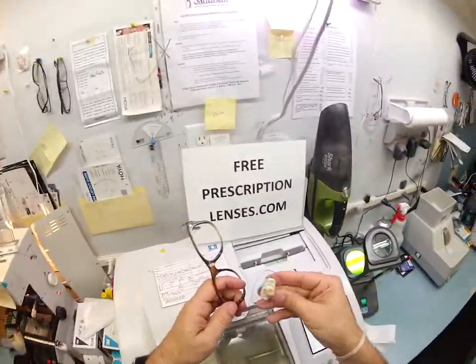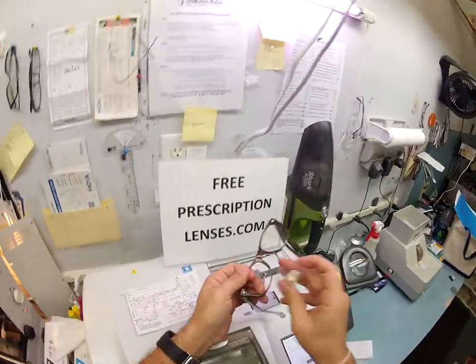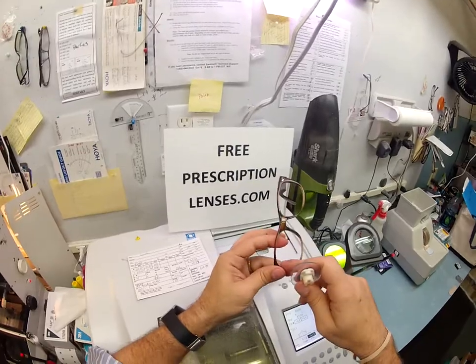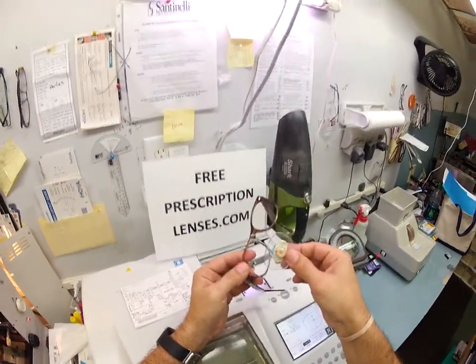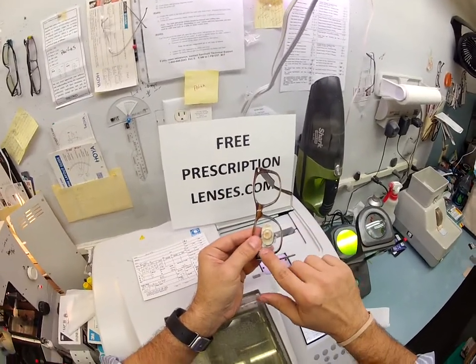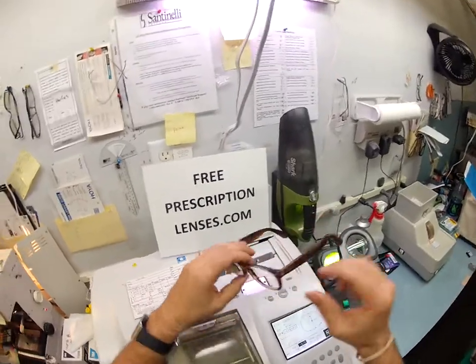Now to see if your lens fits, tuck it in at the outside corner. And Jacek, this is what you're going to need to do. In order to insert the lens, have the frame faced upright. Now I like to have the lens that I'm working on closest to me. I'm not trying to reach over the frame. But while the frame is upright, I tuck it in at the outside corner first, which is closest to me. And then using my thumbs, press down at the nose. It snaps right in perfectly.